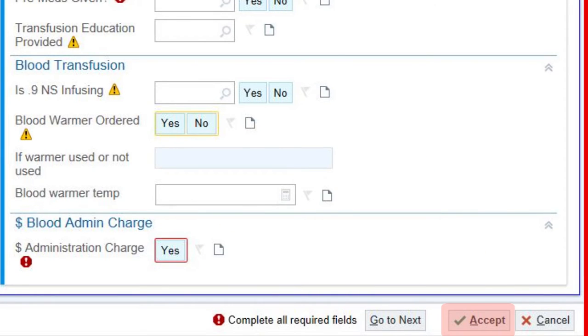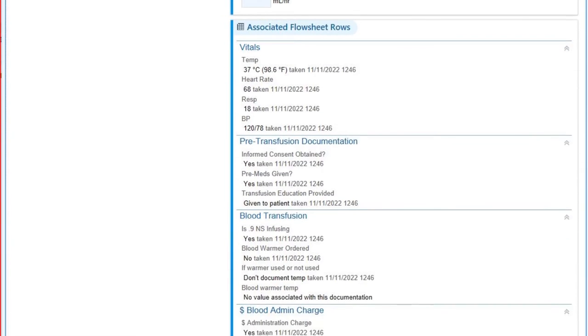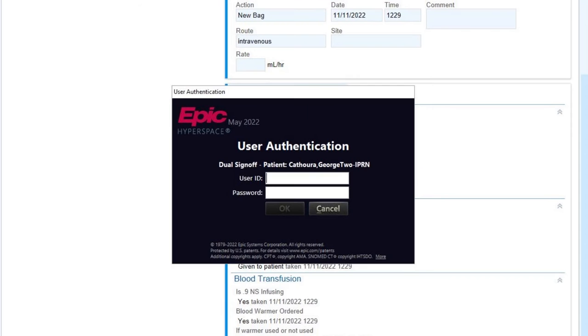After you choose Accept, it will give you a chance to review your documentation before choosing Sign Off at the bottom. It will then prompt you to have your partner sign in, verifying that they completed the double verification process with you and that you've found no discrepancies. After they have signed off, they are free to leave, and you will complete the blood administration process for this patient.